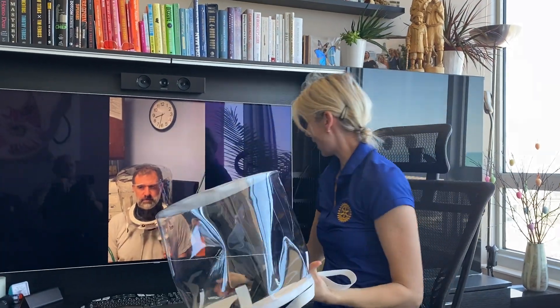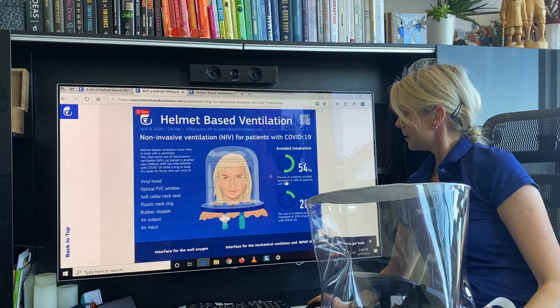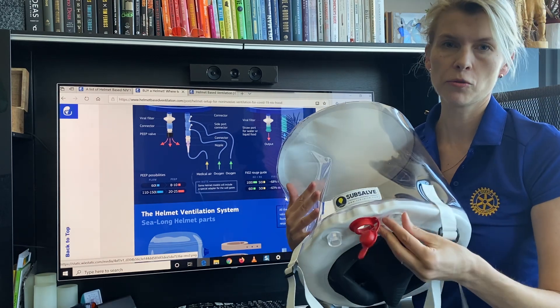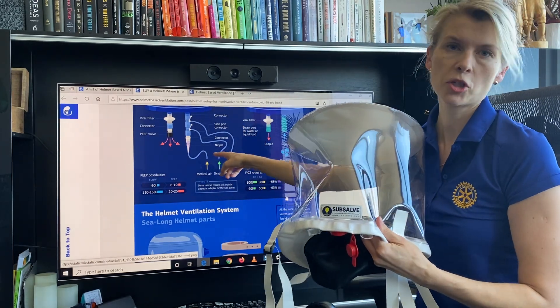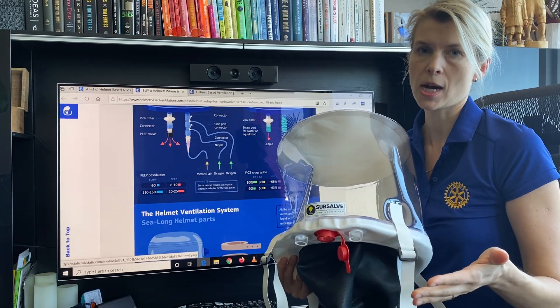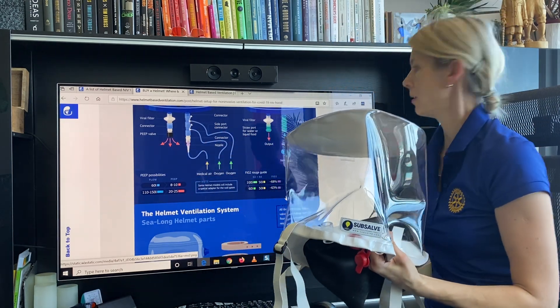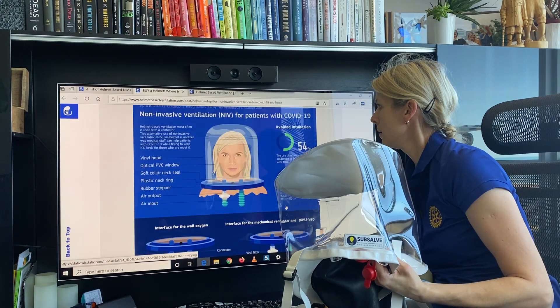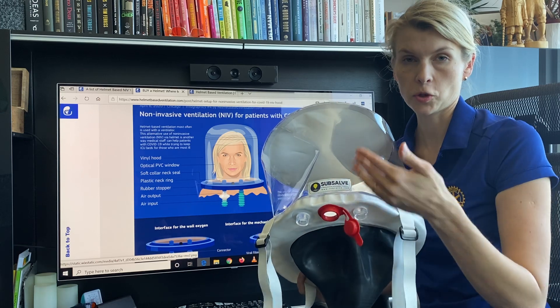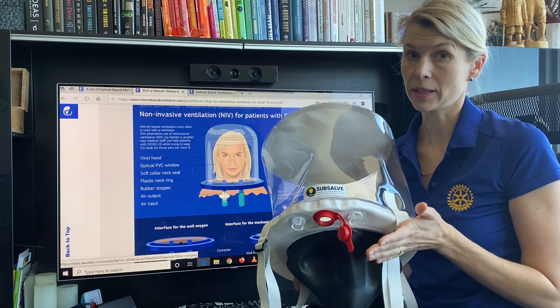Now I will show you how this helmet is connected. For the inlet, you can choose any of the ports — you will have your oxygen connection and medical air, based on how much oxygen the patient will need. For the outlet, this is where you have the filter and PEEP valve. This helmet can be connected to wall gases as shown in the picture. It can also be connected to a BiPAP machine or a ventilator.